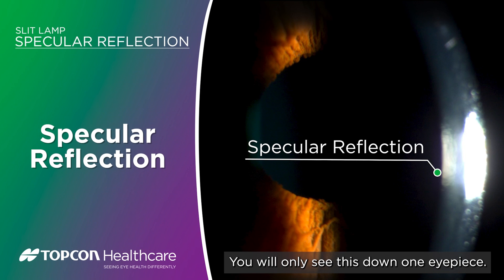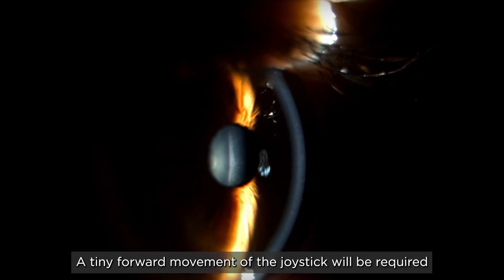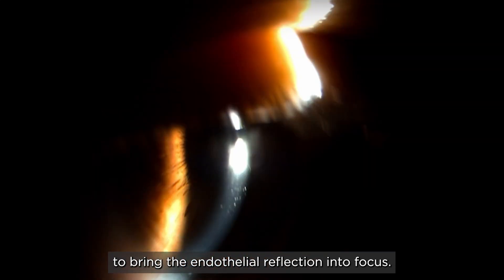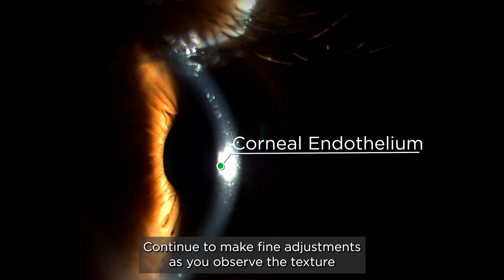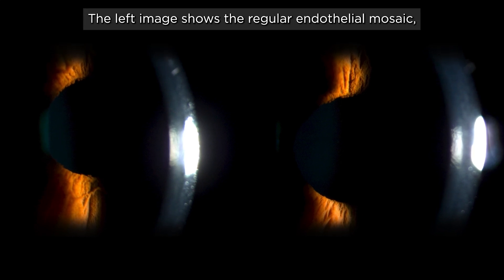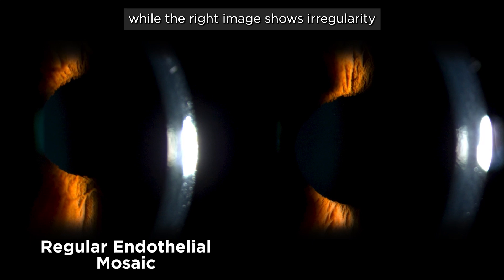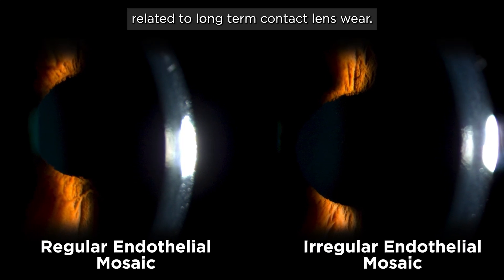This is the specular reflection of the endothelium. You will only see this down one eyepiece. A tiny forward movement of the joystick will be required to bring the endothelial reflection into focus. Continue to make fine adjustments as you observe the texture of the corneal endothelium. Here we have two examples of specular reflection off the corneal endothelium. The left image shows a regular endothelial mosaic, while the right image shows irregularity related to long-term contact lens wear.